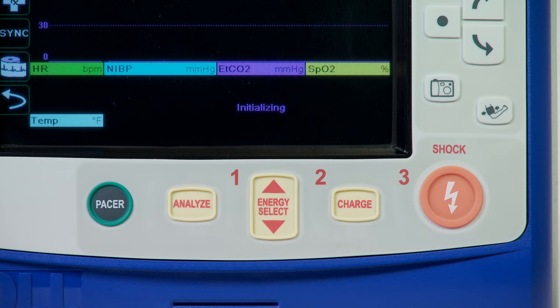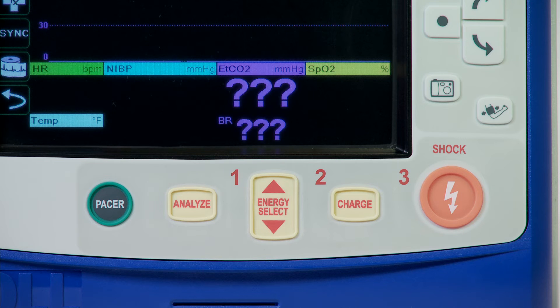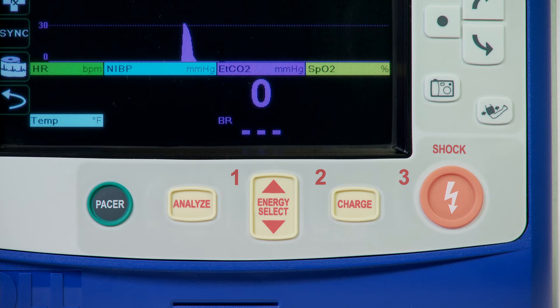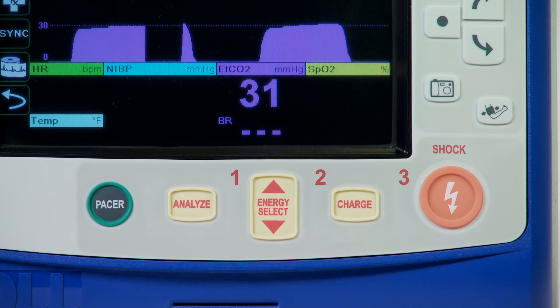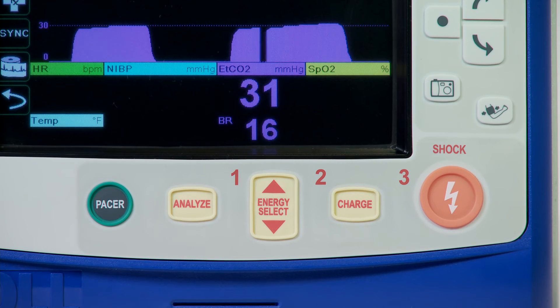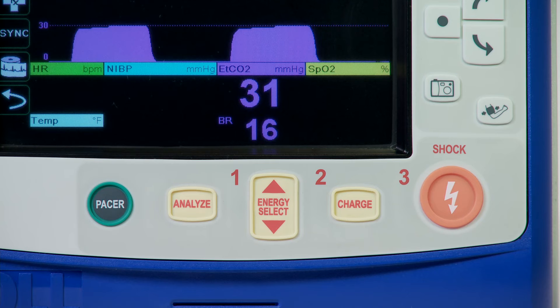In addition, when an occlusion is detected, the device will purge the capnography sampling line on its own. The CO2 display gives the current end-tidal CO2 value — the concentration of carbon dioxide detected at the end of each exhalation — and after a delay of approximately one minute, the patient's respiration rate in breaths per minute, identified as BR.